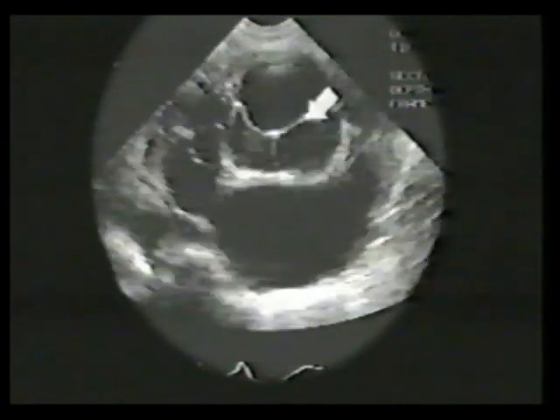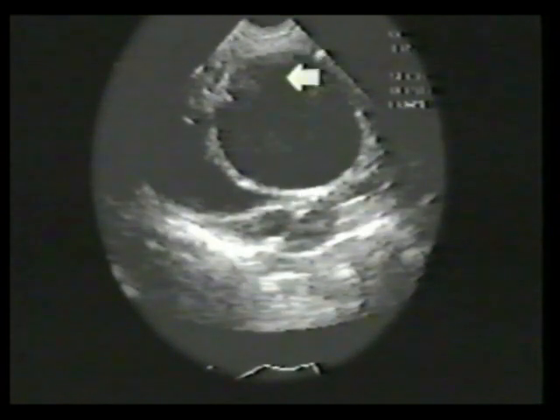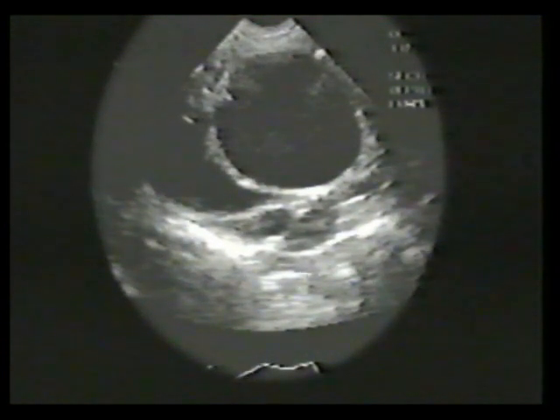We will now scan to the aortic root above valve level. The diameter of the root is 6.5 centimeters. The ascending aorta is being imaged from the suprasternal position. The enlarged root is pear-shaped, tapering to a normal diameter at the level of the arch.